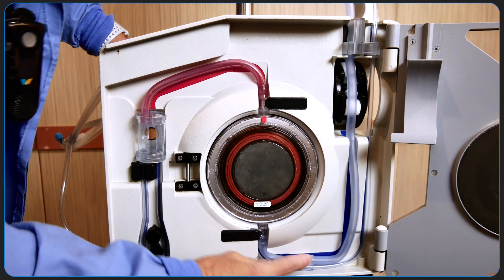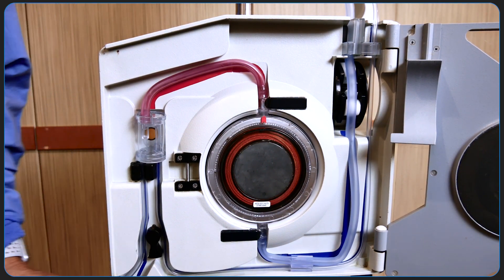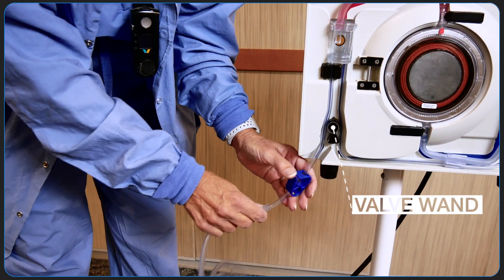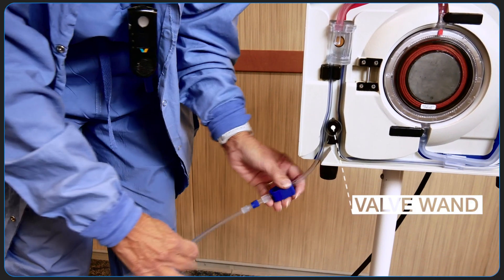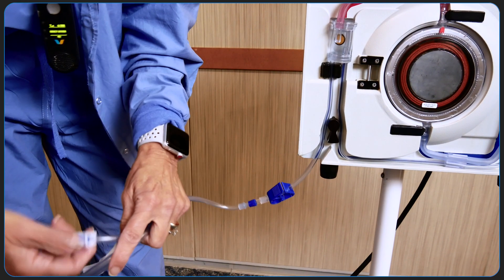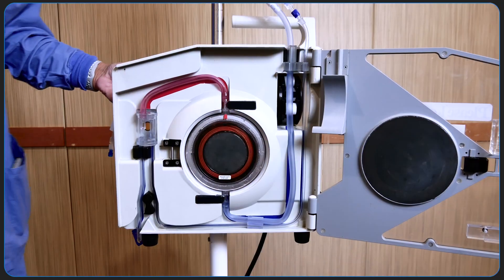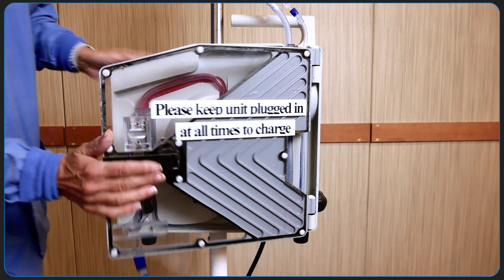This is what the completed installation looks like. This is the infusion line to the patient, and you'll notice that it diverts to the left of the valve wand. You'll want to confirm that the tubing is open and that all connections are tight. You can now close the Belmont door and lock it.